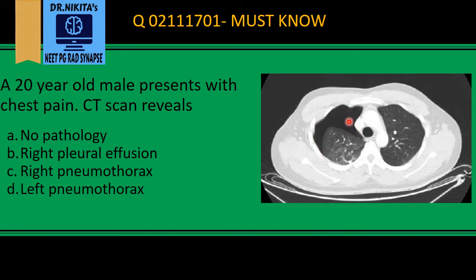There is black pathology here — black on a CT or an X-ray, a deep black like this, represents air. So there is air accumulation, which gives us the 'pneumo' part. This is a pneumothorax because this air does not have any vascular markings — it is plain black air.